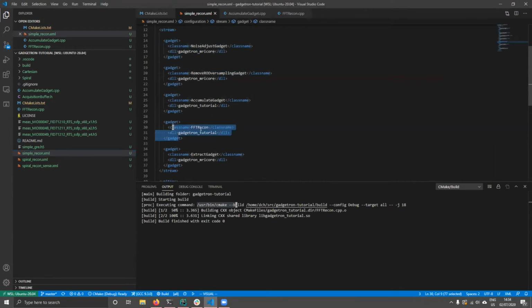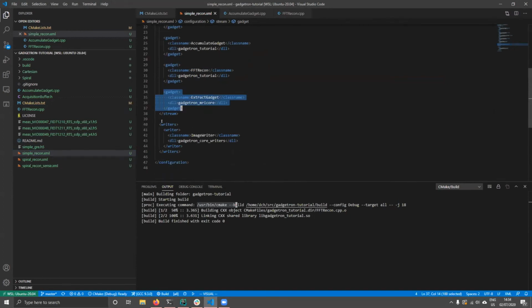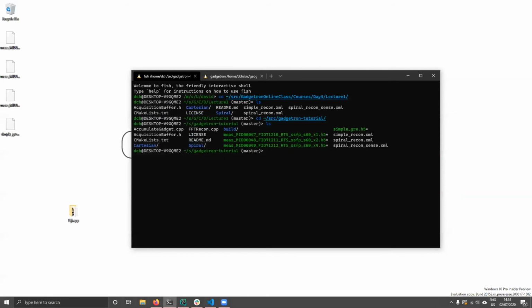So actually the FFT recon gadget creates a complex image. They're kind of hard to look at. So we add an extract gadget to create a magnitude image. And then finally, we have an image writer. So we get the image back. So let's see what we can do. We're gonna run the client.